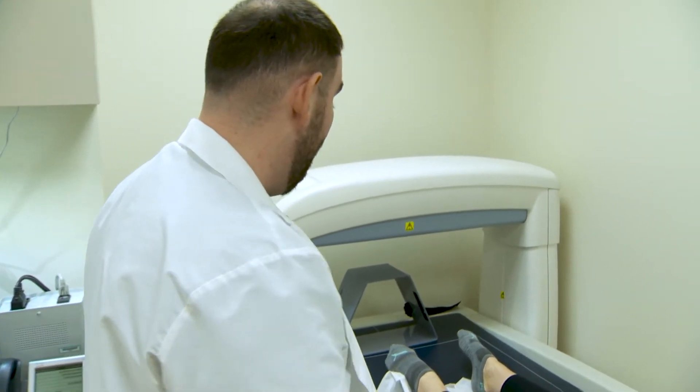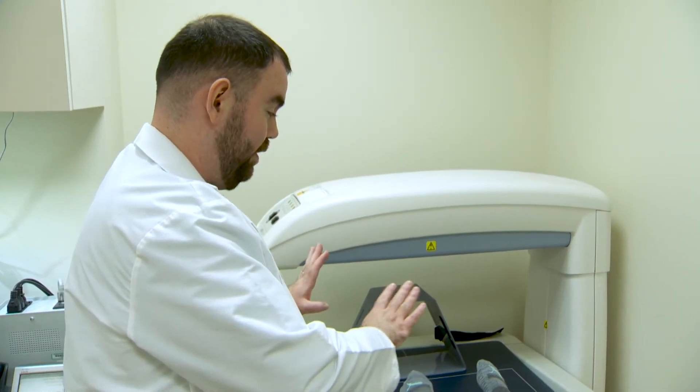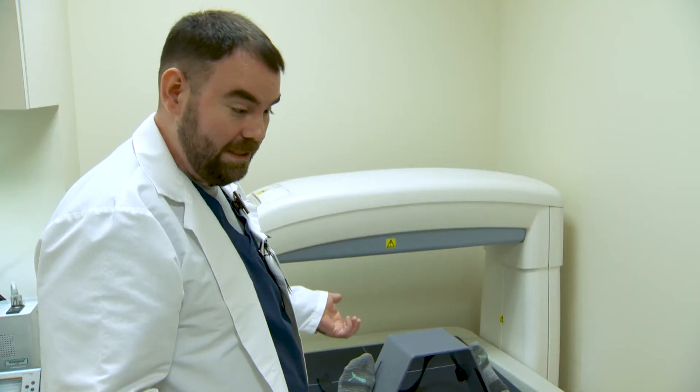For the hip scan, what we'd be doing is putting a foot positioner between your feet. I'll have you bring both feet apart from side to side. Then we put a little Velcro on you and that's pretty much it.